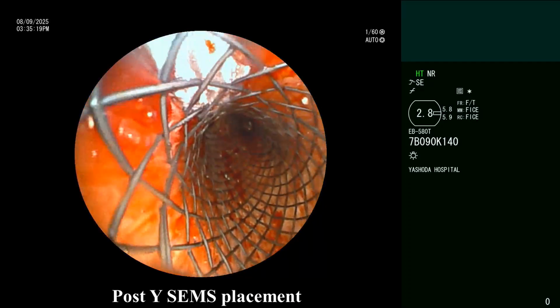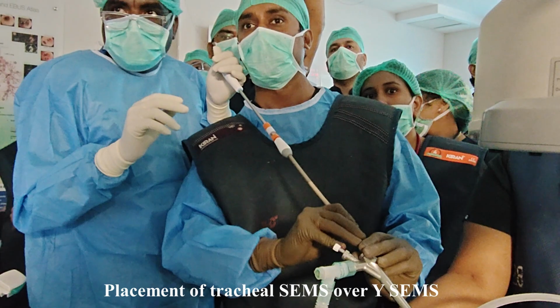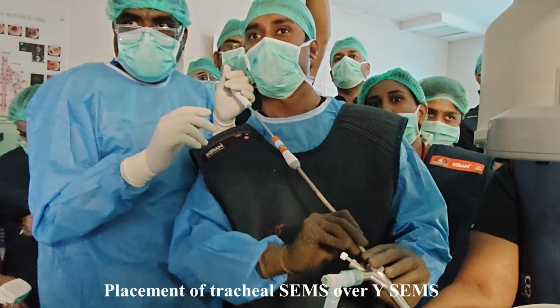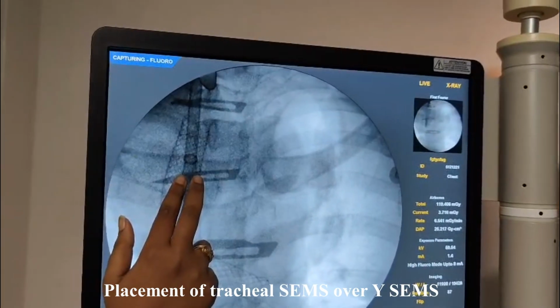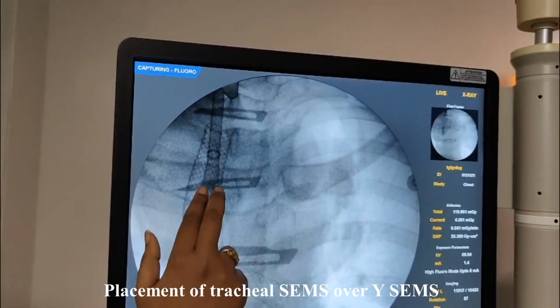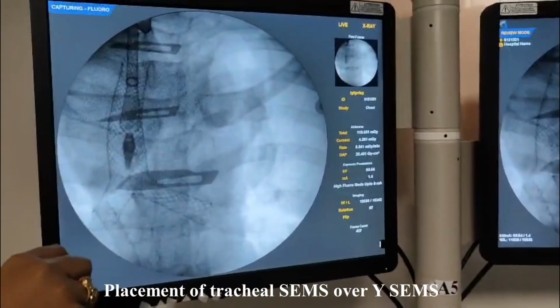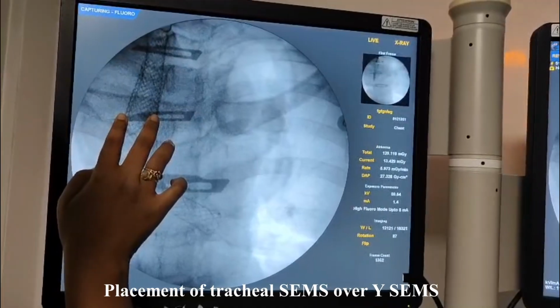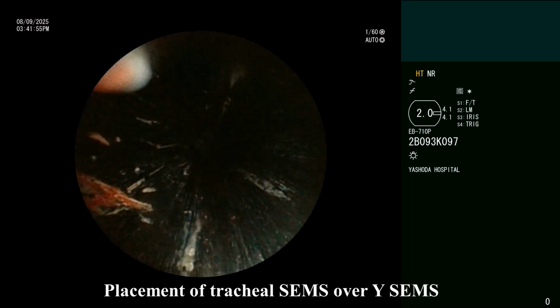However, we continue to have a tracheal stenosis above the level of the self-expanding metallic Y stent. To overcome the residual airway obstruction, a decision for a straight self-expanding metallic stent is being made, and the straight self-expanding metallic stent is introduced through the rigid bronchoscope under C-arm guidance, and gradually it is then inserted into the already existing self-expanding metallic Y stent.